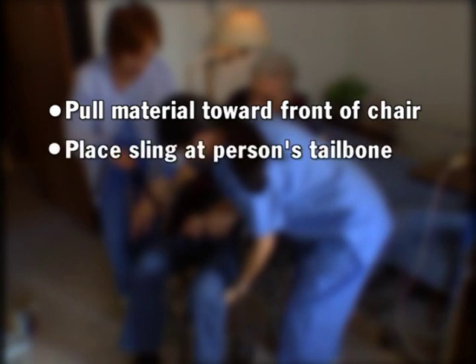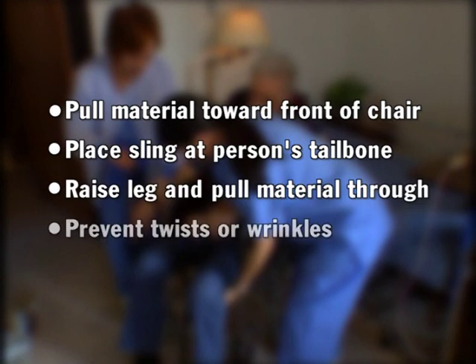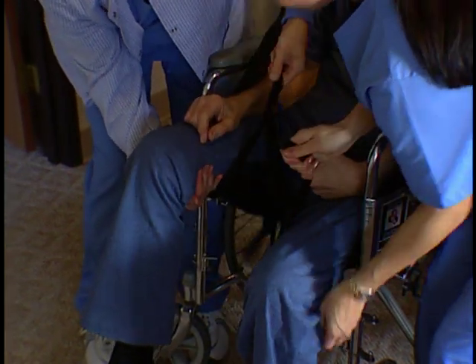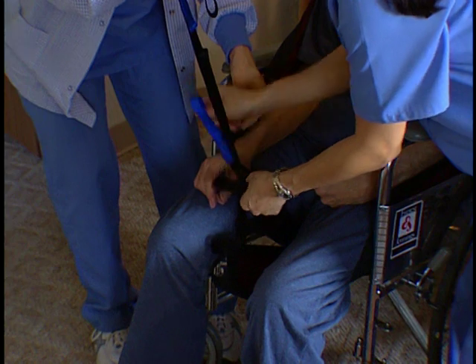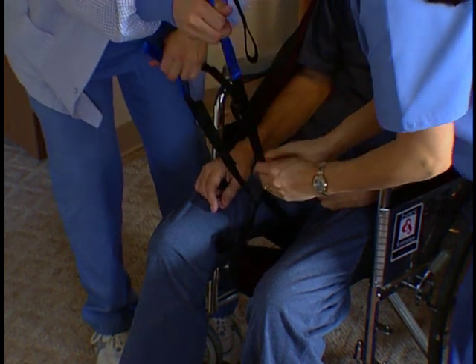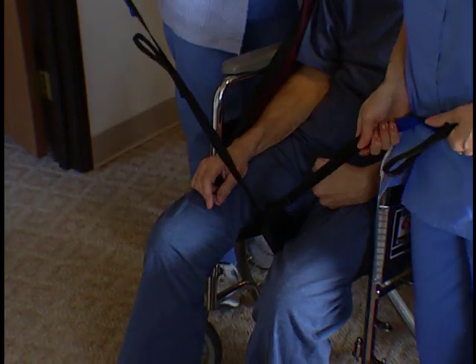If the back of the sling is not placed all the way down to the person's tailbone, the sling will not come under the leg easily. Raise the leg, pull the material through, and try to prevent any twists or wrinkles. Feed either leg strap with color-coded loops through the opening at the bottom of the opposite leg strap. Straps will now be crisscrossed. You are now ready to attach the sling to the lift and transfer the resident.